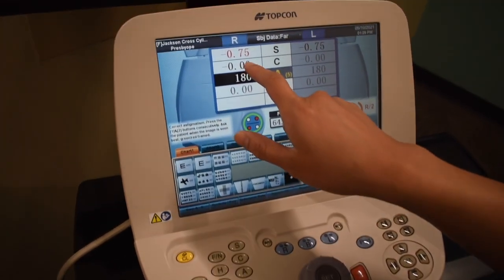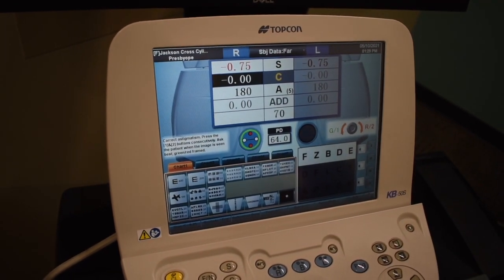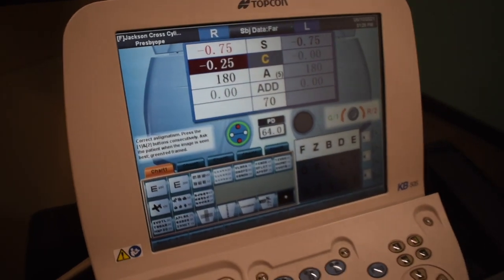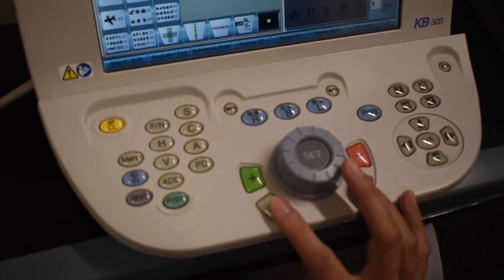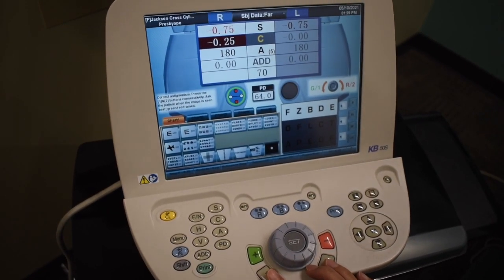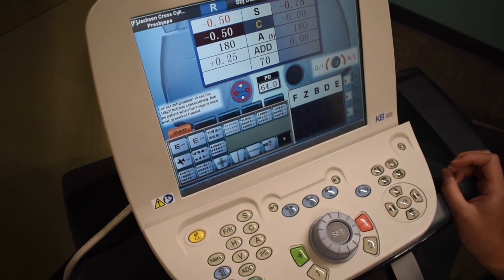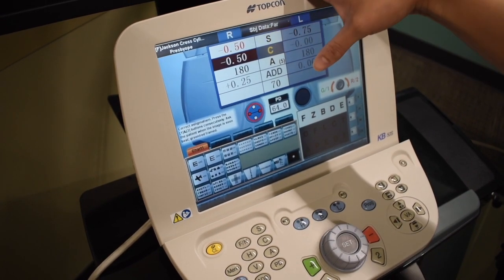Now we have the 2040 line up for Dr. Hefner, and we are going to check the power first — a power check. Since we did not find any cyl on his retinoscopy, we're going to start at 180, which it's at right now. I'm going to be clicking in minus 0.25 and give you two options, one or two — tell me which one makes those letters better. He accepted the cyl, so we will click in one more. The autorefractor automatically adjusts for the spherical equivalent.